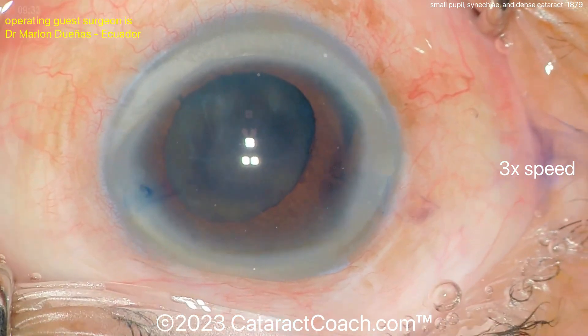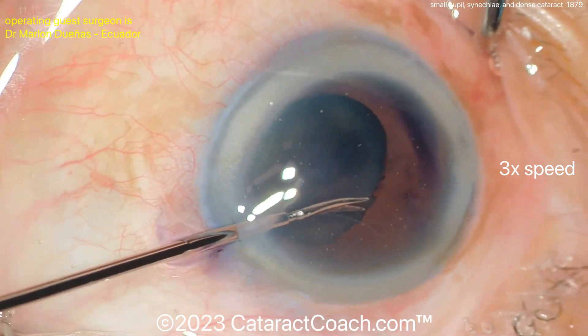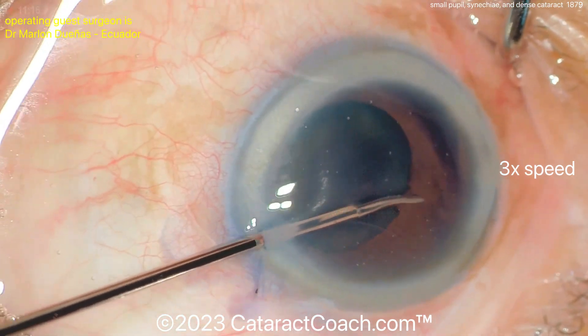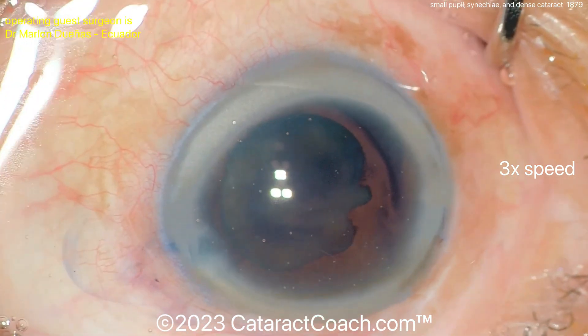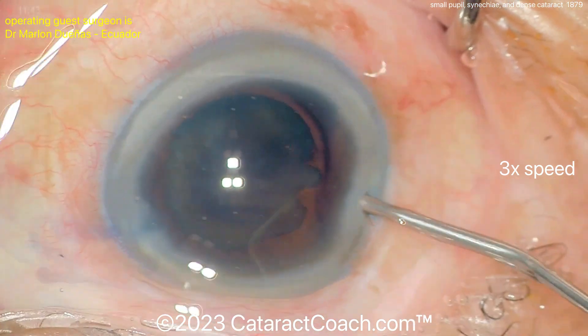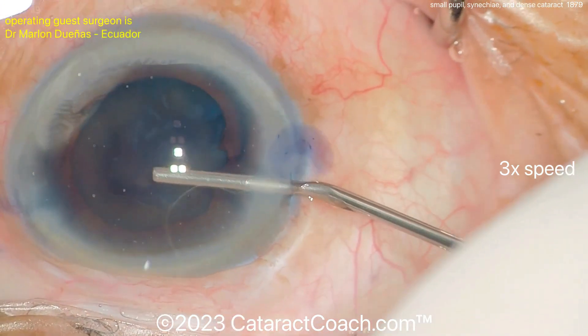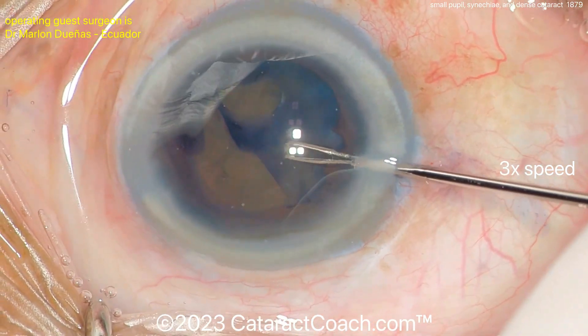There are some micro sphincter tears, which is to be expected. With more viscoelastic the pupil is still a little asymmetric on dilation, so the surgeon uses micro scissors to do a sphincterotomy — a couple of small cuts on the pupil sphincter. Then more viscoelastic, which should really open up that pupil.